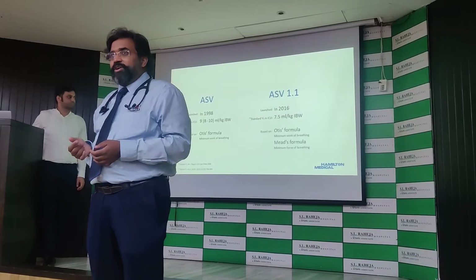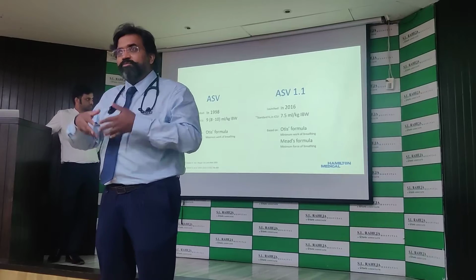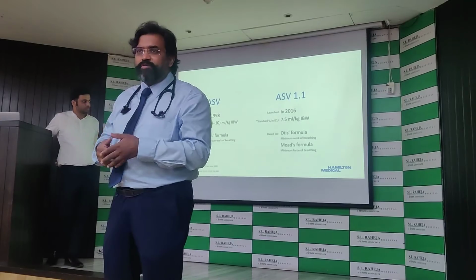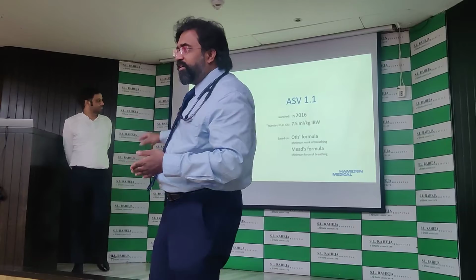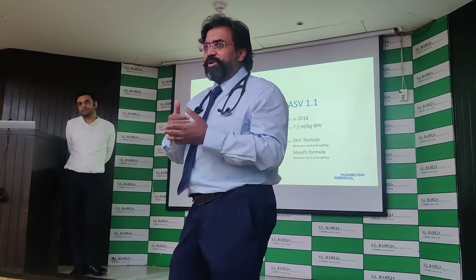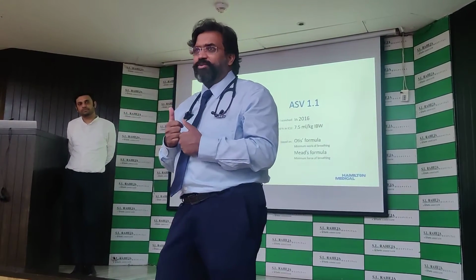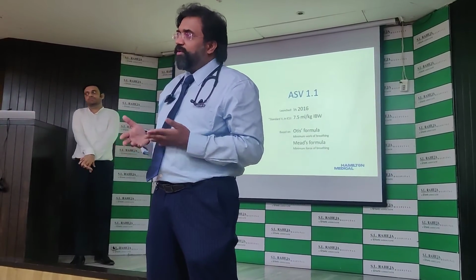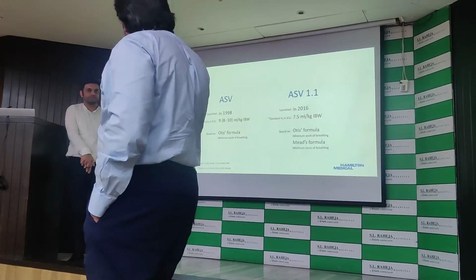You're understanding. So that's why if you don't even monitor plateau pressure, it becomes really, really bad. If you have not monitored the plateau pressure at all, then you feel, what are you monitoring? So if your patient is on the ventilator and you have not mentioned plateau pressure, I feel they don't understand that at least the plateau pressure should be found. So when you are writing your notes and the plateau pressure is not there, you feel, this person is not looking at the plateau pressure. Because I want to know what it is. If it is 30, it is normal, but I want it much lower.